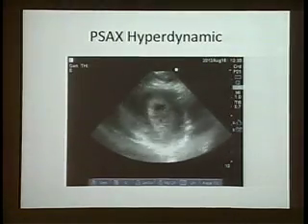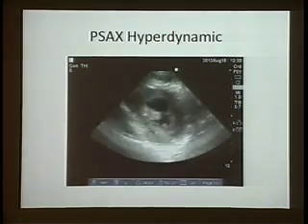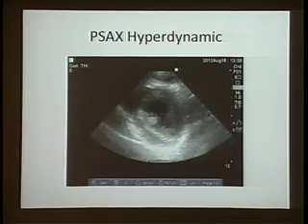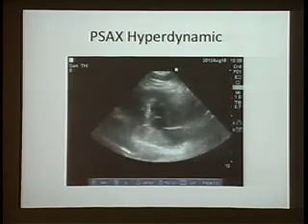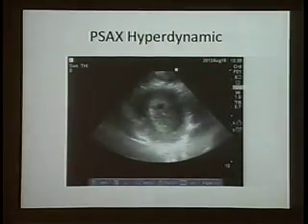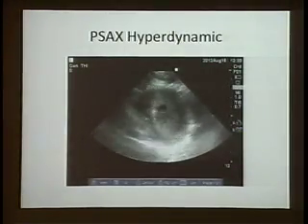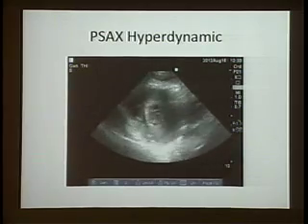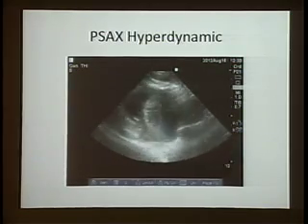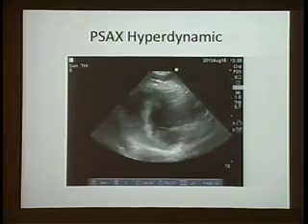Look at this one here. This is truly empty. We have what we call the kissing sign. The papillary muscles are touching each other. That means you're either very empty, or it could mean you're very vasodilated. When you have a low tone state, the end systolic volume goes very low. So that can be also the problem. So if you're hypovolemic, that's your clinical impression, you solve this with fluids. If you're hyperdynamic, you might give a little bit of fluids, but what you need is basically tone to improve this.